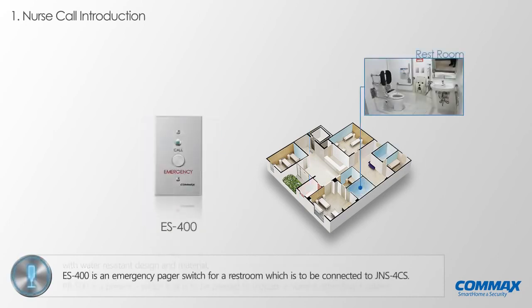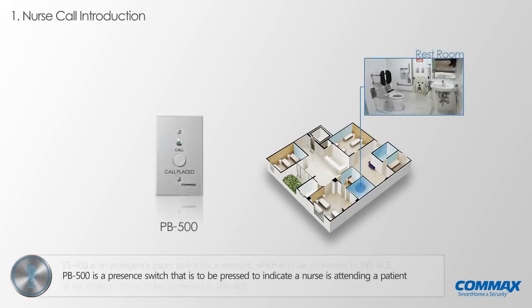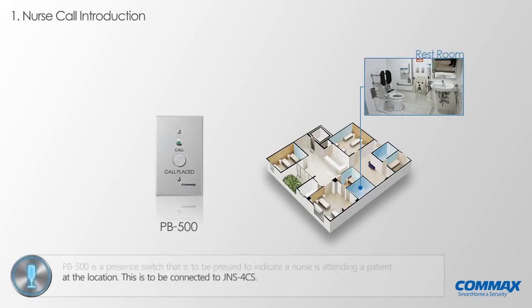ES400 is an emergency pager switch for a restroom which is to be connected to JNS 4CS. PB500 is a presence switch that is to be pressed by a nurse to indicate that a nurse is attending a patient at the location. This is to be connected to JNS 4CS.